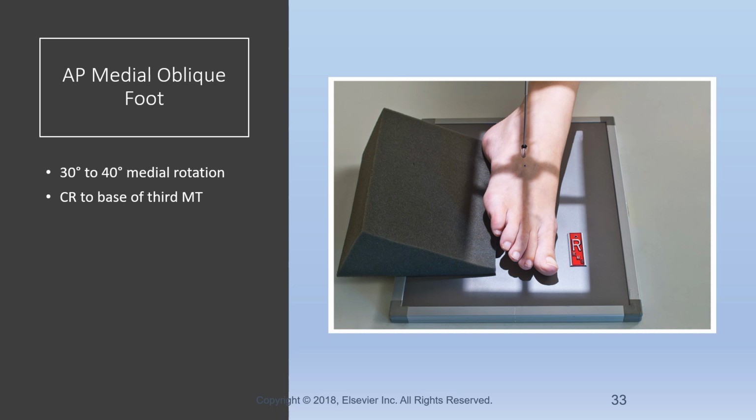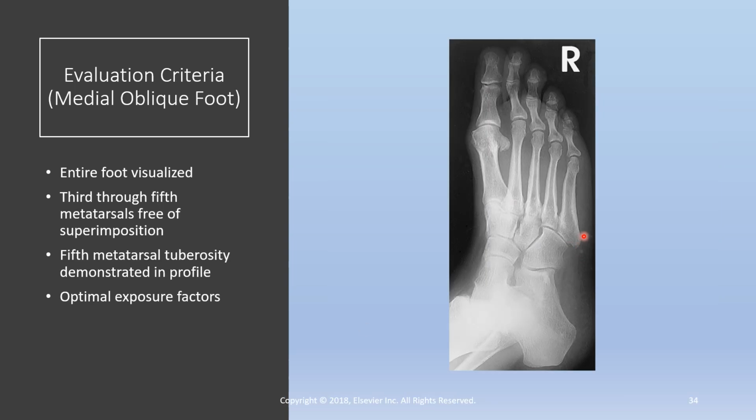All right, so if we move forward with this is the tuberosity at the base. But see how, if you look at the base of the third is here, which is in front of the tuberosity here because they're kind of at an angle. So you find the third digit, follow that down. Right here would be your central ray. All right, so you're getting the entire foot.